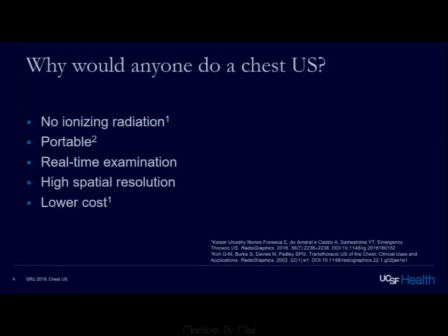So why would anyone do a chest ultrasound? As I alluded to before, a lot of the chest imaging, especially when looking for bones or lung parenchyma, is done with radiographs and CT. And so ultrasound is not our primary imaging modality. It is frequently employed by our emergency department colleagues, however, because it can be rapidly done at the bedside. You don't have to move the patient.